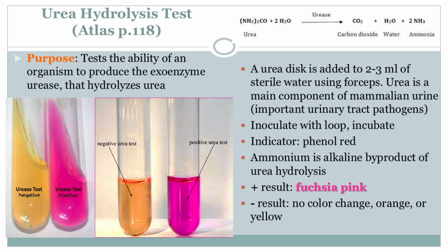This urea hydrolysis test is clearly a handy tool for microbiologists. Right, but it's not just about what happens in the lab. So how does this actually impact, say, someone who's not a scientist? Let's say you're a doctor and a patient comes in. They've got all the signs of a UTI. Yeah. Painful, frequent urination, the whole nine yards. And you need to figure out the best course of treatment fast. So knowing whether the bacteria causing the problem is a urease producer or not, that's vital info.